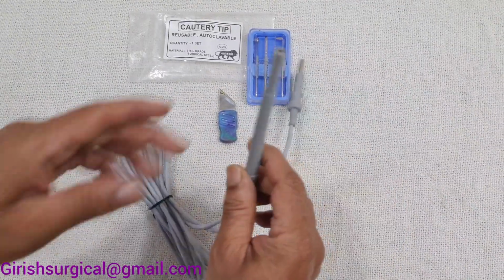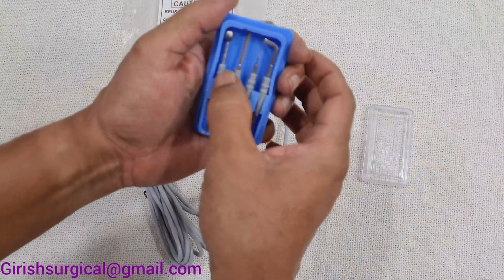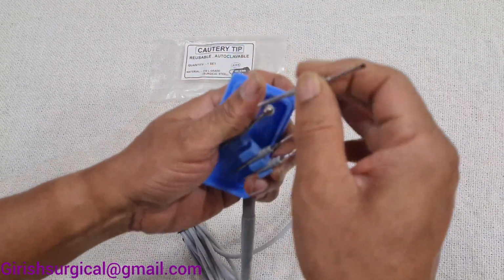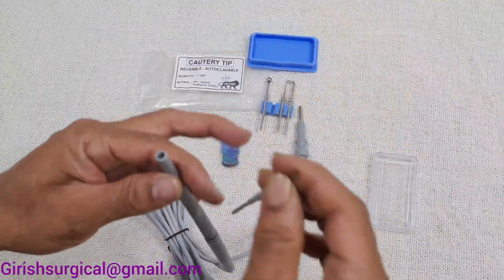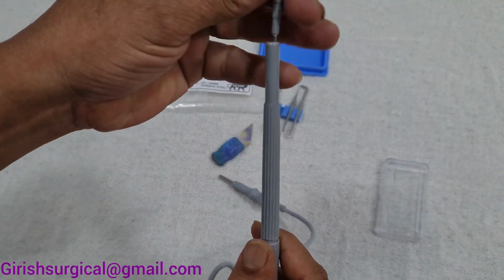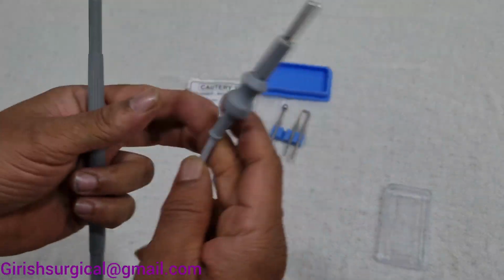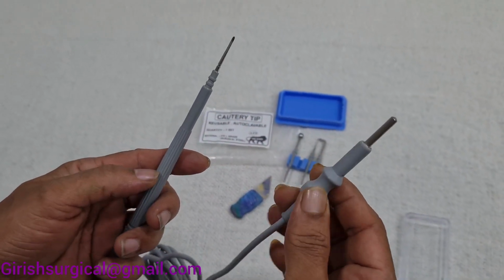One active handle. This is the electrode set of four. In this there will be a ballpoint flat cutting electrode, pointed electrode, and the angular flat cutting electrode. This electrode, you can use it like this. You have to open it a little, insert the electrode and tighten it, so this will not move. And at the other end, there will be a jack pin which you insert into the active port.